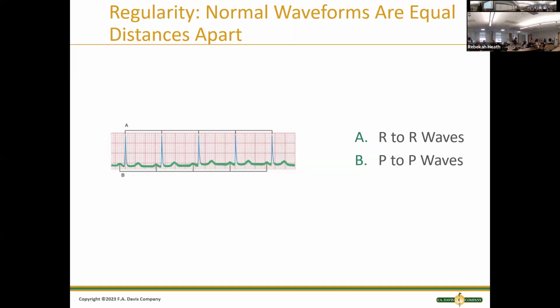If you feel like you have it really good, check with your neighbor. So you want to put it on the paper. There, and then on the next QRS. Then we have our measurement. So then we go down. Down. Down. We want to see if everything measures up.